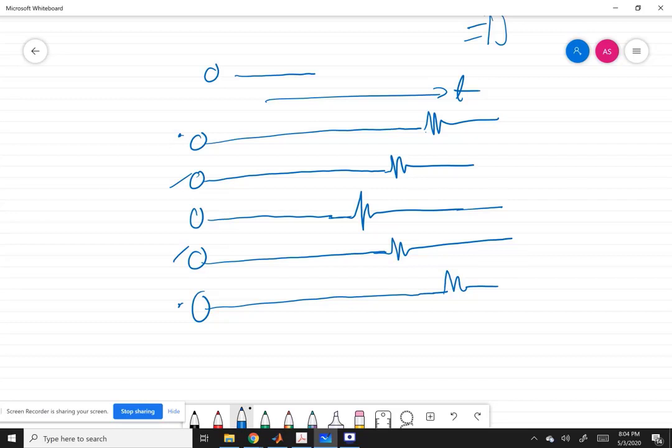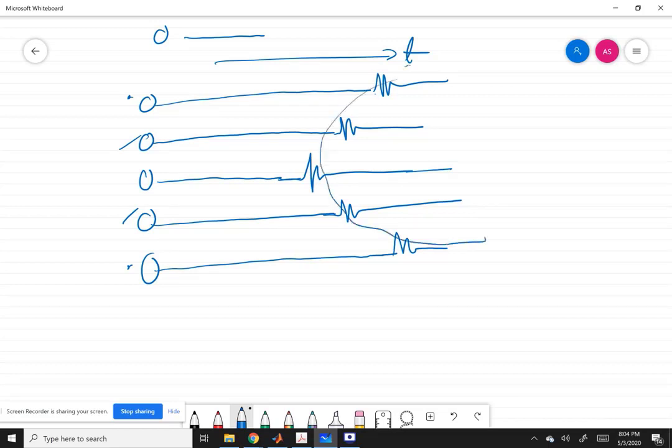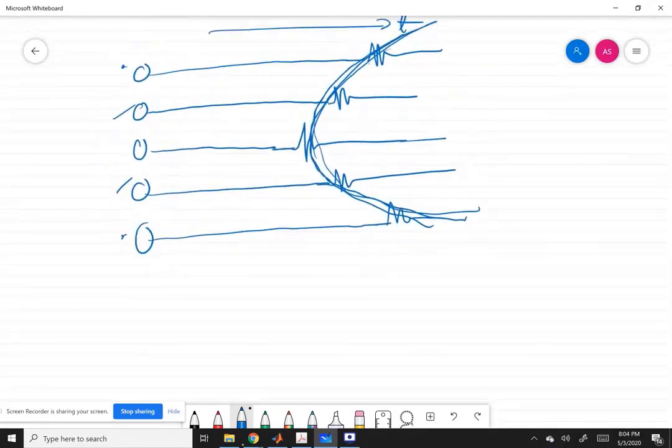So what you can see is, even though there was a single point, when it arrives at all the transducers, our observation transducers, they arrive at different time points. So a single point is showing up as a bow kind of signal. And if you have 2 points, then you will have 2 bows.